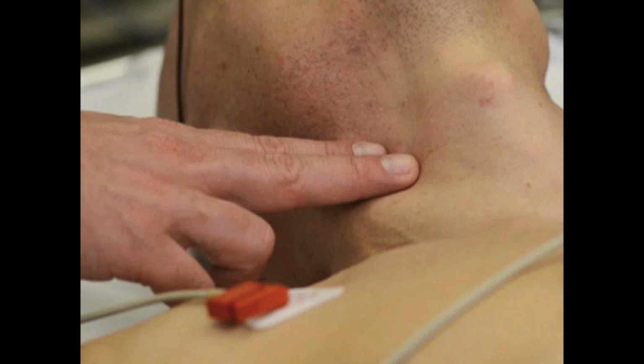Now, it may not be a new concept to you that we are not very good at checking the pulse when we're stopping CPR and seeing if we have return of spontaneous circulation. We just have adrenaline, the patient may have really low blood pressure, and we're just not very good at this. So some people put arterial lines in, some folks use the ultrasound to see if there's blood flow moving there, but we're not good at it. And the other thing that we're doing is we're looking at the rhythm strip. We want to know what rhythm do they have, because cardioversion is another thing that can really help these patients. Early cardioversion, get them out of that bad rhythm, VFib, VTach, and into a perfusable rhythm.